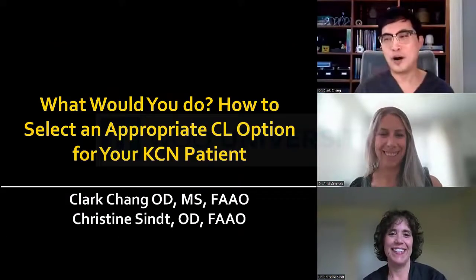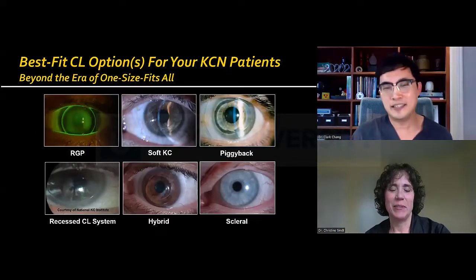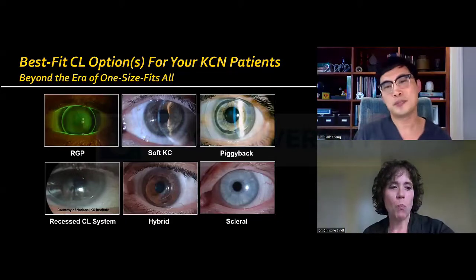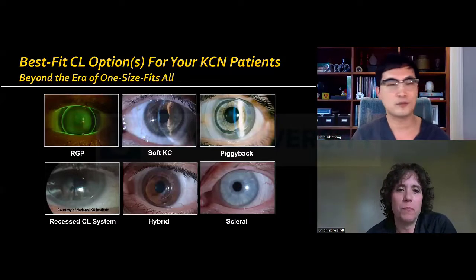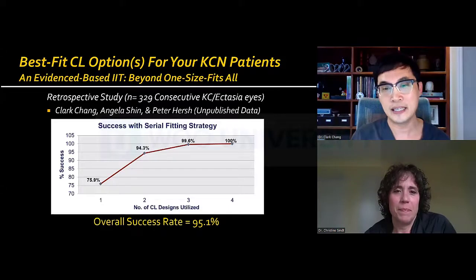Thank you. Okay, so I know we got lots to talk about, and as in our usual fashion, we always try to pack in more than 1 hour of CE content into 1 hour. So let's get this started. So I want to talk about, obviously, with the rise of scleral lenses, and it's very exciting, but I think Dr. Sindt and I thought this would be a good reminder for us to say, don't feel like you are being left in the dust, or for your patients, if your first recommendation is not a scleral lens. There's still times where other lenses can actually be quite appropriate and sometimes even have a higher rate of success.